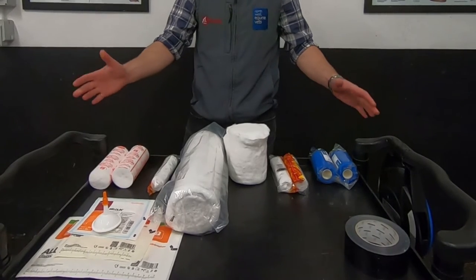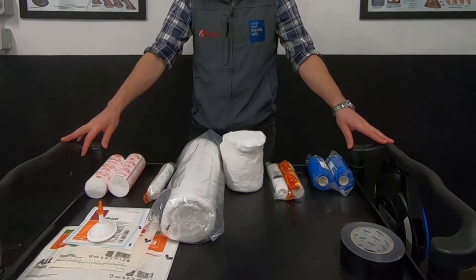Hello, I'm Richard Knight, one of the vets at North West Equine Vets. I'm here to talk you through a brief demonstration of how to apply a lower limb bandage. First things first, right on the table in front of me are all the materials you are likely to need to apply your lower limb bandage.